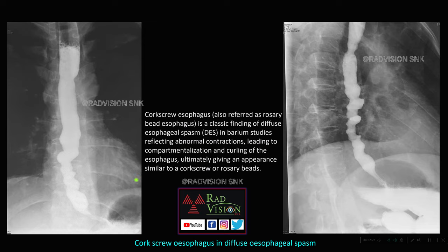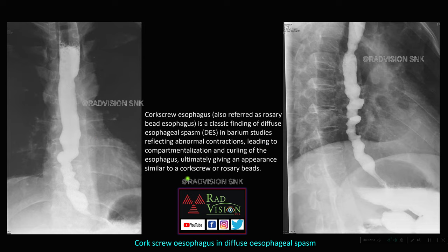Here you can see abnormal beading and dilatation of the lower one-third of the esophagus. Here also you can see abnormal beading and dilatation of the middle and lower esophagus. This appearance is called corkscrew esophagus or rosary bead esophagus, classically seen in diffuse esophageal spasm. These are abnormal contractions leading to compartmentalization and curling of the esophagus, giving this corkscrew and rosary bead appearance.